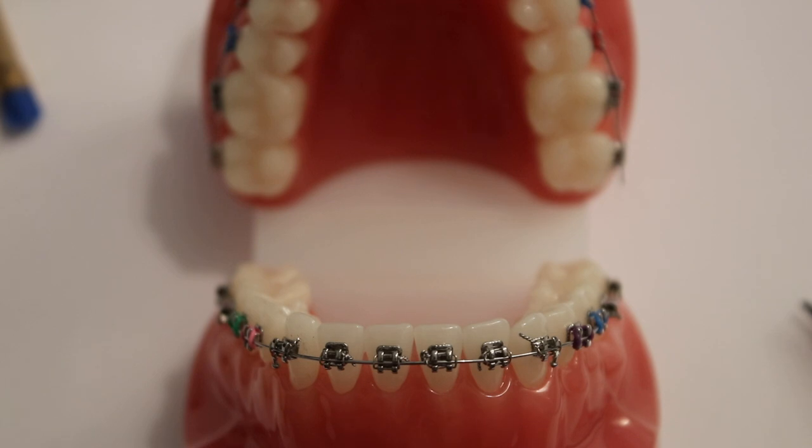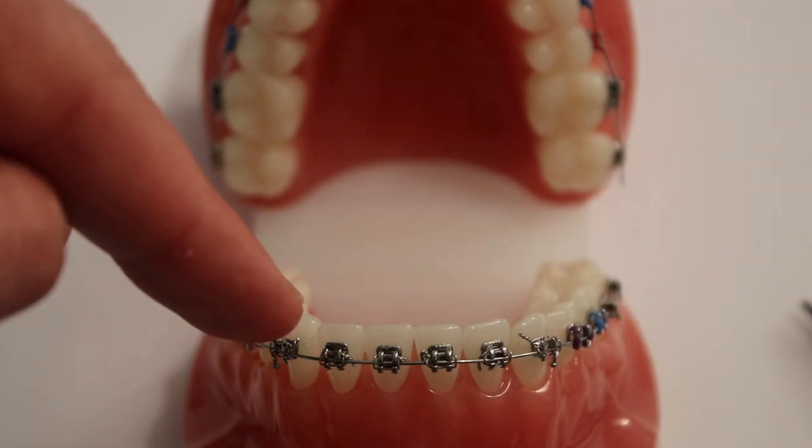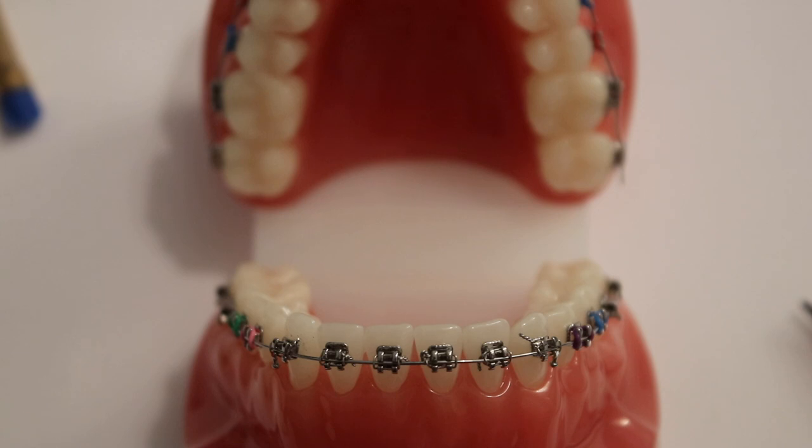During treatment, your orthodontic provider may have used metal ties to secure the wire into the brackets. During eating or cleaning your brace, you may find that the end of the wire or pigtail becomes proud. This can cause irritation or ulceration.